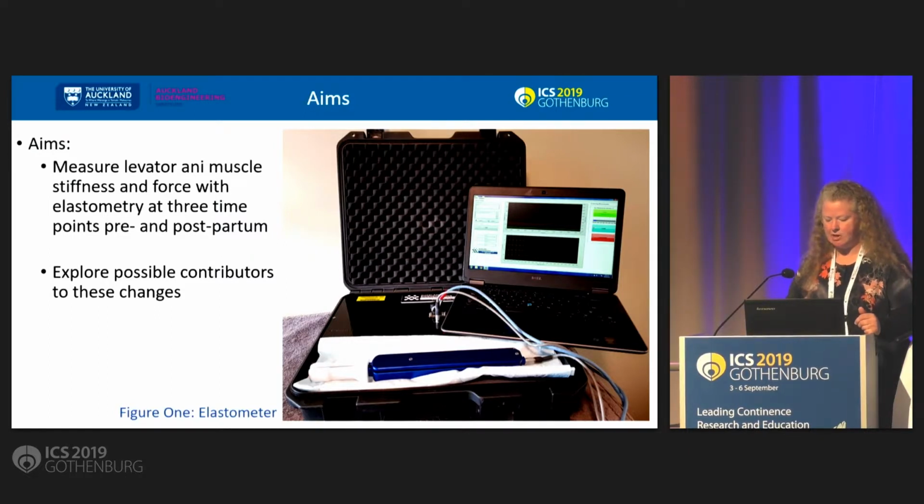So this is the elastometer developed at Auckland Bioengineering Institute to measure muscle stiffness changes in the levator ani muscle. It is a handheld, automated, instrumented speculum which opens in a transverse direction and measures force at varying lengths of displacement over a set cycle.